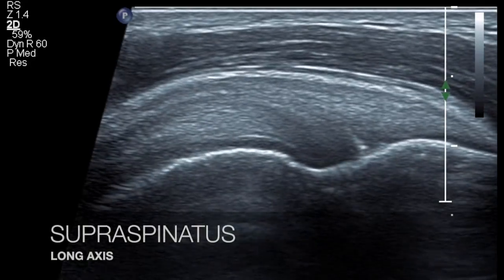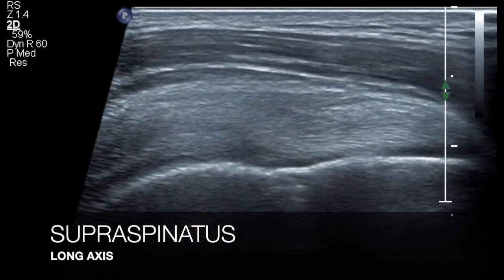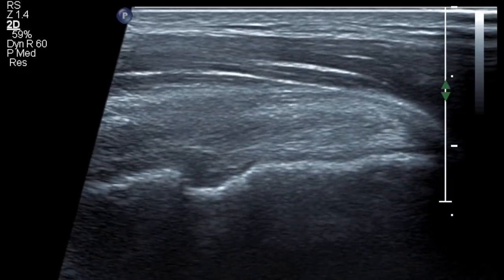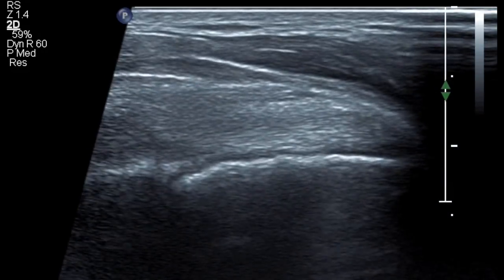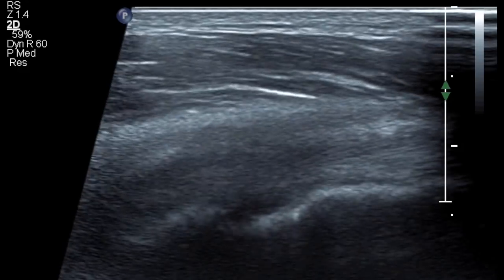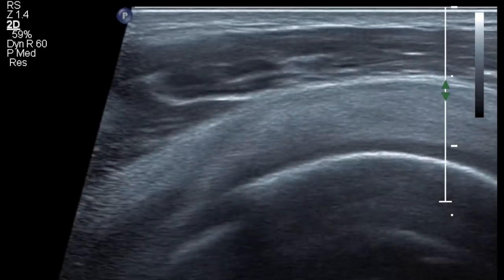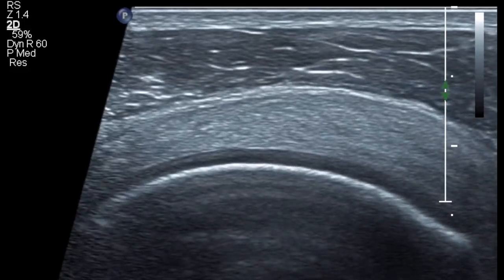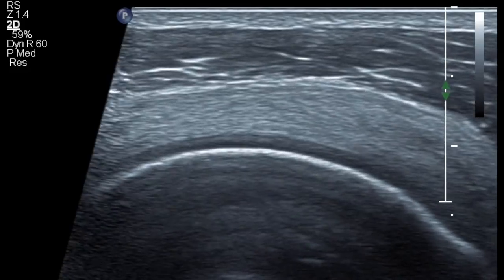You assess the long axis of the supraspinatus and keep your probe longitudinal onto the greater tuberosity, and you will get the footprint of the supraspinatus. You assess the supraspinatus in its length and breadth, and as you can see, as you move from the anterior aspect to the posterior aspect, the shape of the greater tuberosity changes.